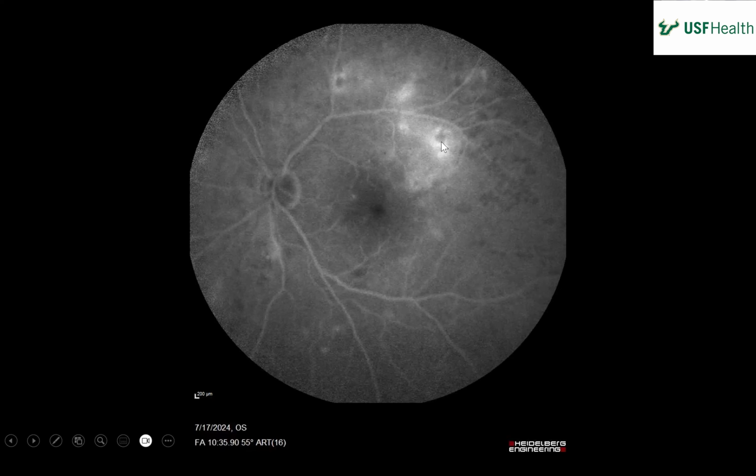That's one of the problems with the OCTs. The OCTs aren't that functional. They don't show you leakage, because sometimes there'll be leakage without swelling. When we got our OCTs, I was shocked that for some of the patients the OCT looked totally different from what I thought. Because you get a fluorescein like this and you think there was swelling and maybe do laser and everything, and then you get the OCT and there's absolutely no swelling.